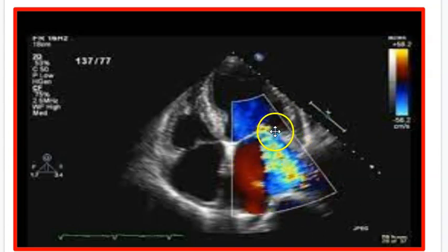I didn't mention this, and we'll mention this in Echo 2, and that is, you got to remember that this blood was pumped back into the left atrium. See, we get the pulmonary vein filling here, the right upper pulmonary vein. And also remember that this blood that's going back into the left atrium, there's also blood in the left atrium, right? A little bit in there during systole. And this is going to entrain with that blood in there.